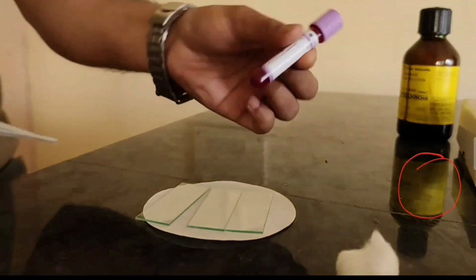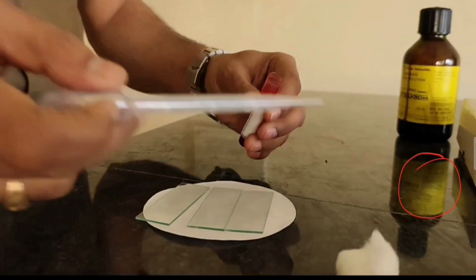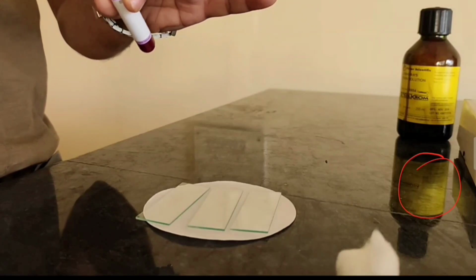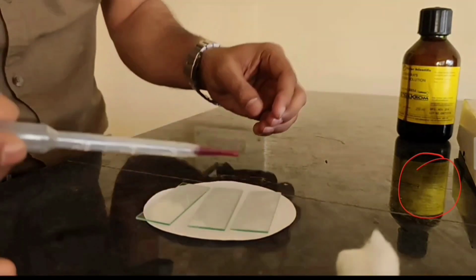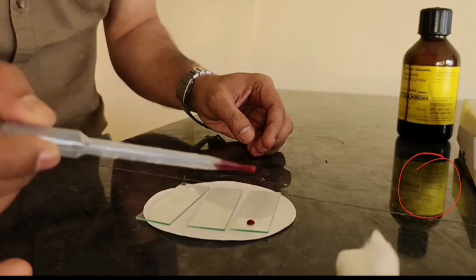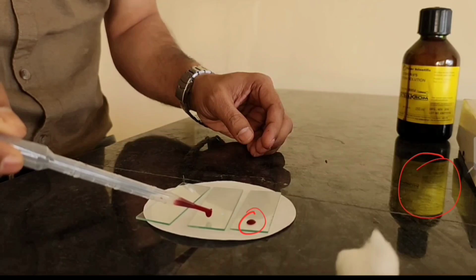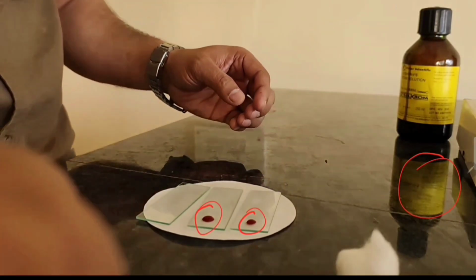And we have a blood sample here. We can directly prick our fingertip and put the blood drop here, or we can use an anticoagulated blood sample, obviously. So here we are going to use an anticoagulated blood sample. Yes, this is one drop, away from the margin. This is the blood drop, and this is another blood drop, a medium sized blood drop.